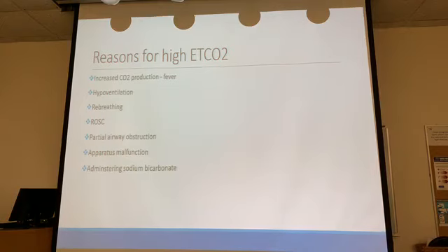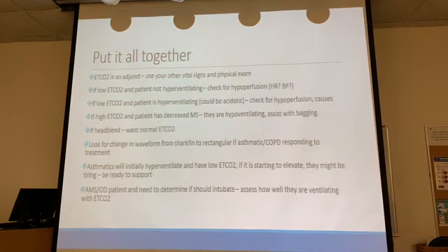That's why I hate giving bicarb. You want to resuscitate the patient, unless you've got a terribly acidotic, hyperkalemic patient that's coding on you, obviously. But when you do, don't let it fool you. That's why it went up. So put it all together, all right? You've got ventilation, you've got your perfusion.